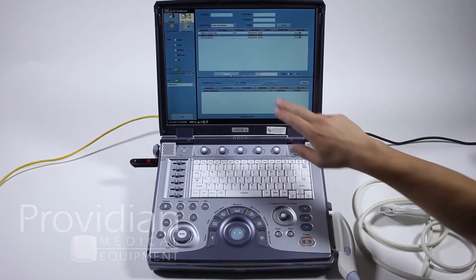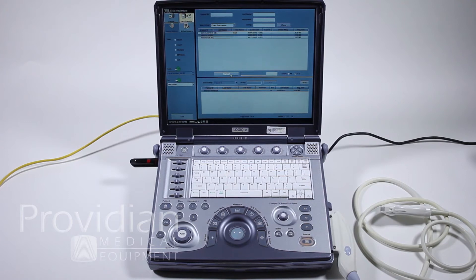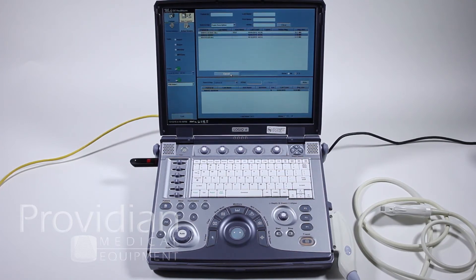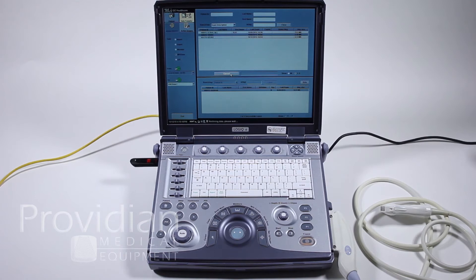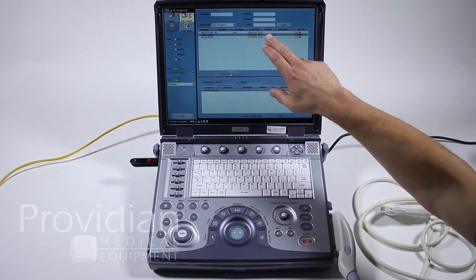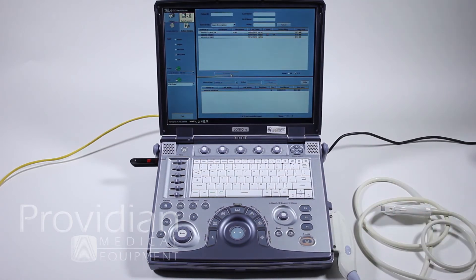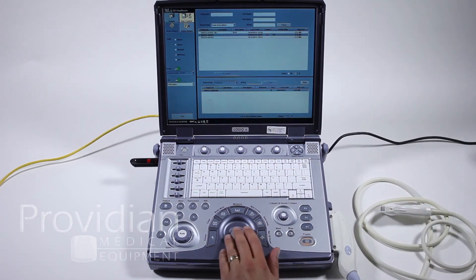I'm going to go ahead and hit transfer. It's going to show my progress along there. When I pull that out and bring it onto a PC, there will be instructions saying start here, and it may ask you to update the software. Right here, it's all been copied to a USB, and we're ready to go. You can simply remove the USB.